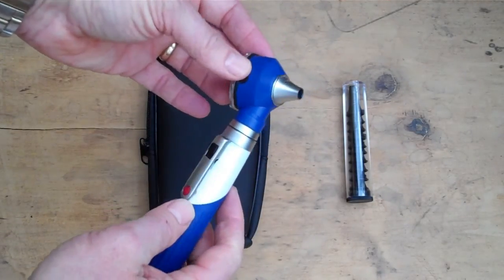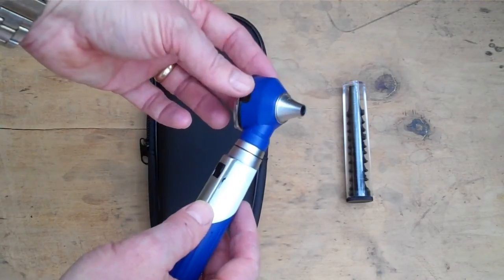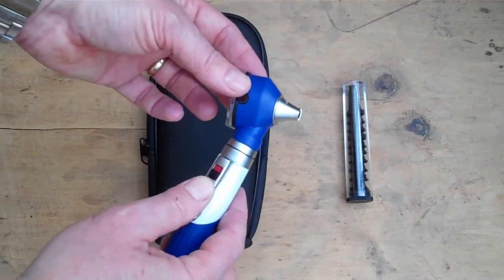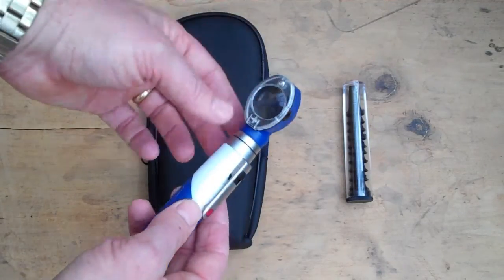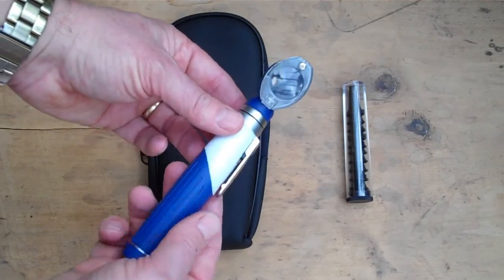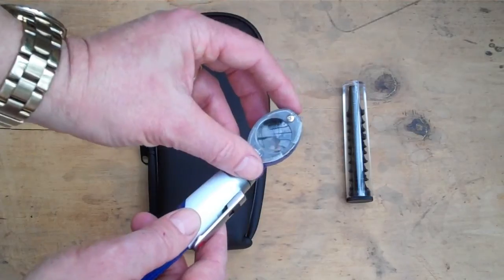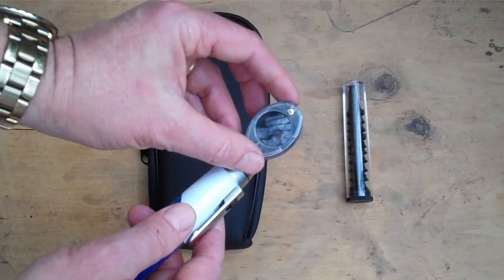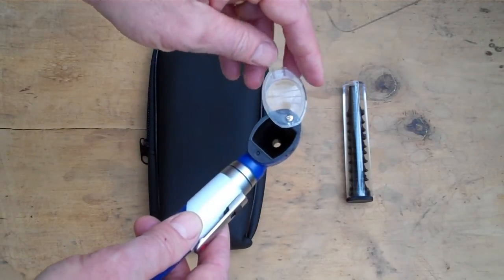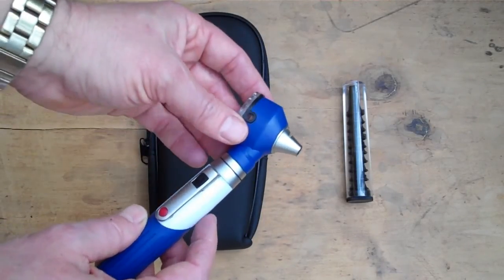The actual mini otoscope is a nicely manufactured piece of kit. It takes two standard double-A batteries which are applied in the base. It does not have a rheostat function — the brightness control is a simple on/off robust switch housed on the side of the unit, with a nice soft grip handle.